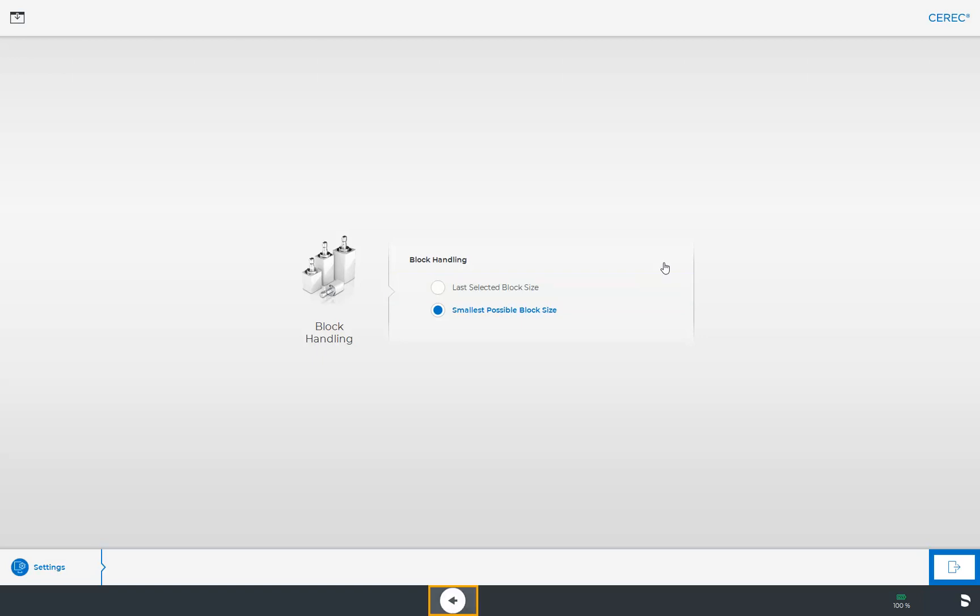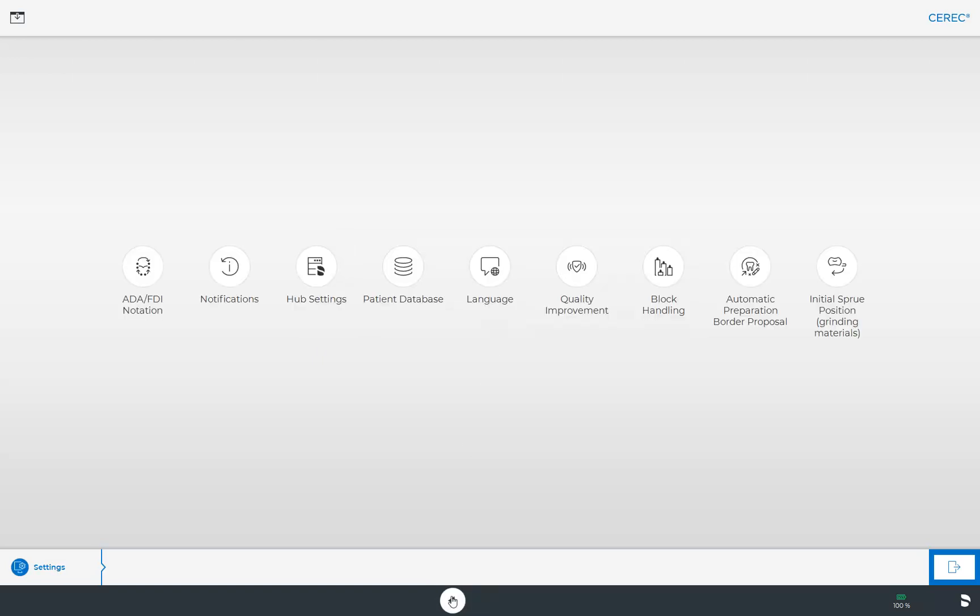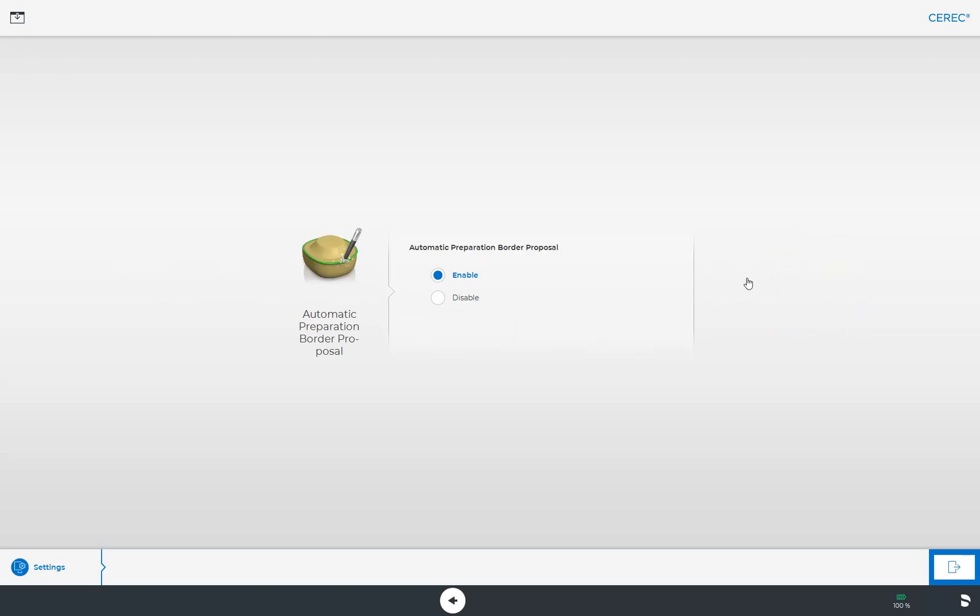We switch back to the overview and tap on the submenu Automatic Preparation Border Proposal. The 5-Click concept of the CEREC software implies that the preparation border of the restoration is drawn automatically. If this is turned off, the preparation border for each restoration must be determined manually.